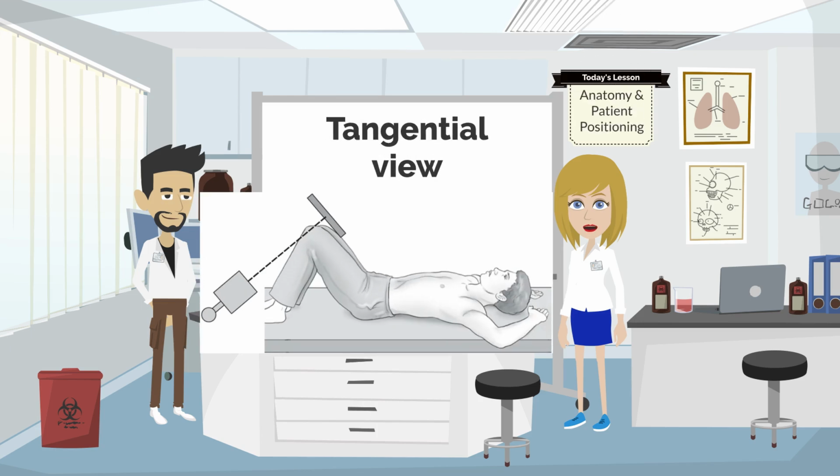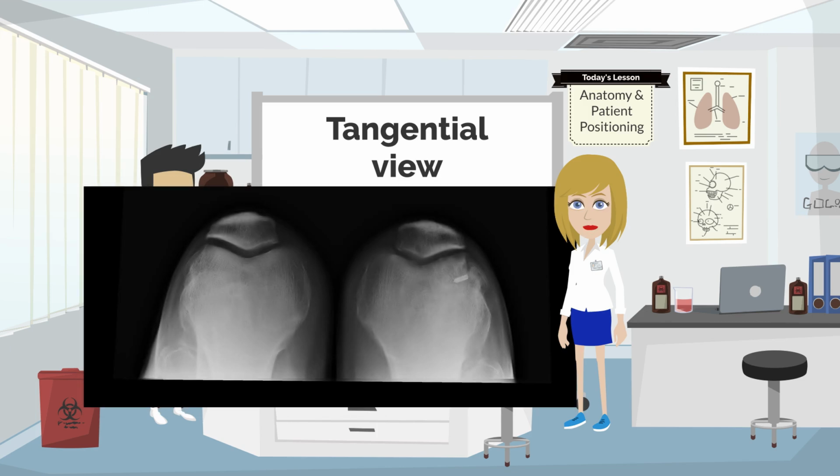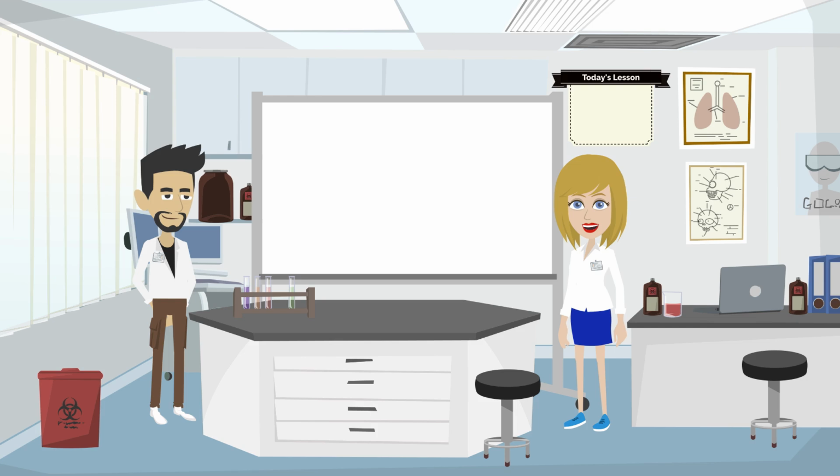The last X-ray projection to mention is the tangential view. This specialty view is produced by directing the central ray to skim the patient's body part in order to isolate the specific body part of interest. A common tangential you will take a lot during your time as a basic machine operator is the patella of the knee. Skimming the patella on a patient with a knee injury will show the patella by itself without the rest of the knee getting in the way of the image.